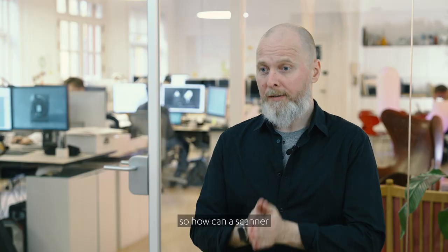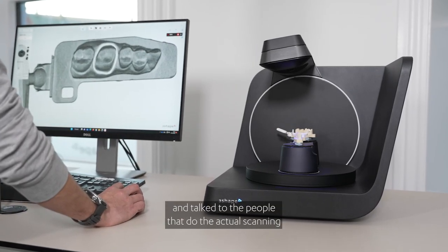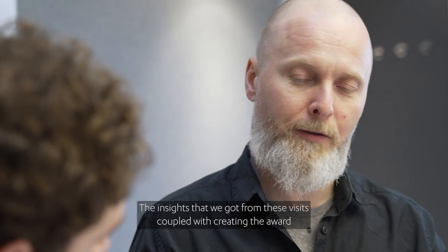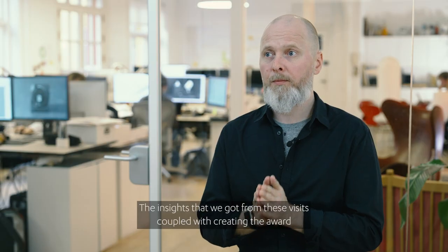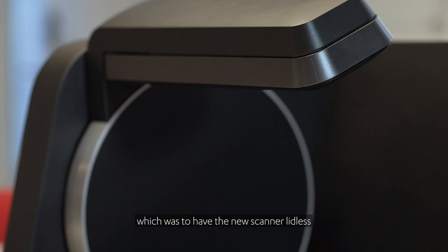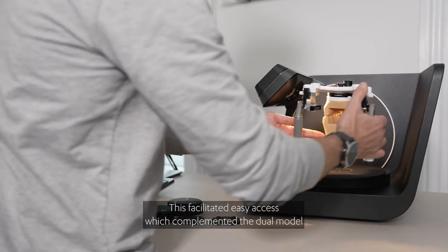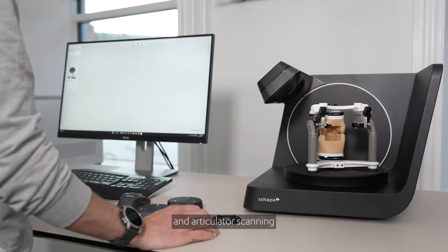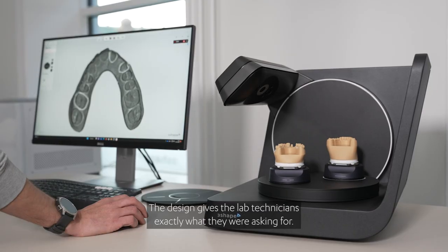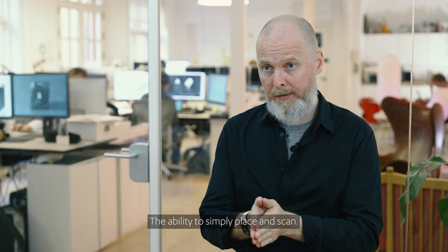So how can a scanner's design help you as a lab technician? To answer that question, we visited many labs and talked to the people that do the actual scanning day in and day out. The insights that we got from these visits, coupled with creating the award-winning e-scanner line, led us to making this important design decision: to have the new scanner lidless, or in other words, open. This facilitated easy access, which complemented the dual model and articulator scanning, and at the same time allowed for sharing between workstations. The design gives lab technicians exactly what they were asking for — the ability to simply place and scan.